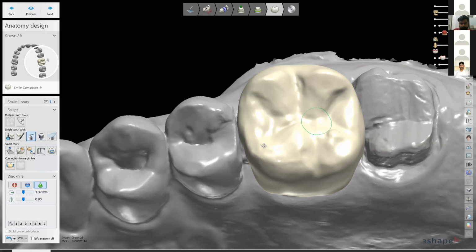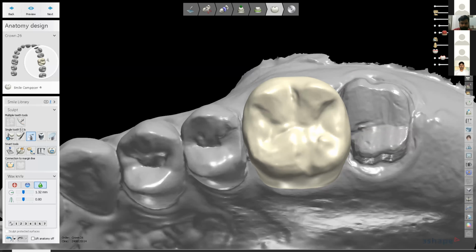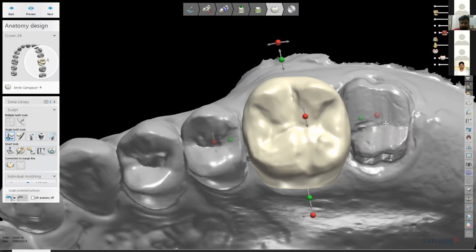For maxillofacial defects and implants, using MIS software, we mirror the contralateral part. We can also design with the software which we use for maxillofacial. But I guess there you will be facing the margin lines and all, right? There you have the margin lines and all.